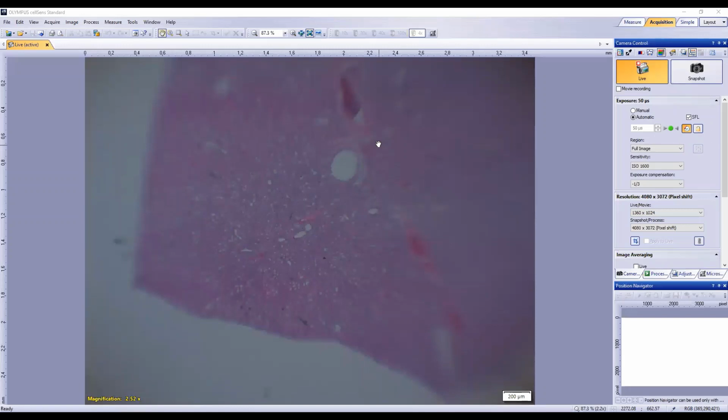So mentally, increasing our magnification power, what would we be looking for specifically if these were thrombi? I think fibrin in the first instance, and maybe some bacteria in there. Potentially, yeah, depending on what process is going on. Now, using histology descriptive terms, what's fibrin going to look like?